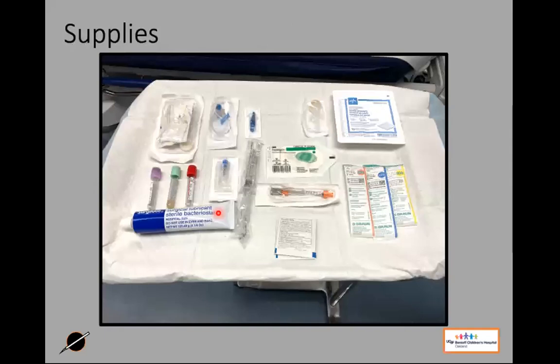All right, some supplies that we need for this. We need some extra supplies than we would normally use for our traditional IV insertion. So we want to use some sterile gel. At the time I took this picture, this is what we had in the department. We now have the Surgilube, and the Surgilube works well. It's a nice small packet. And then we actually found some old sterile ultrasound gel as well. They're in that small cubby in between trauma 1 and trauma 2, up in the cabinets.